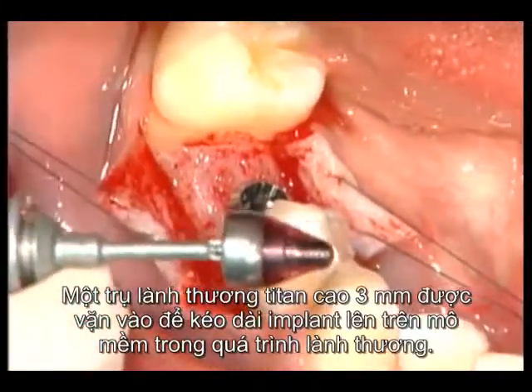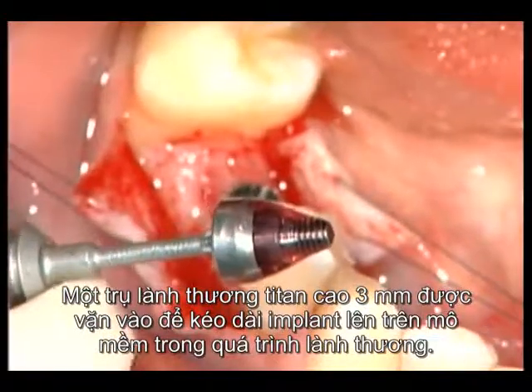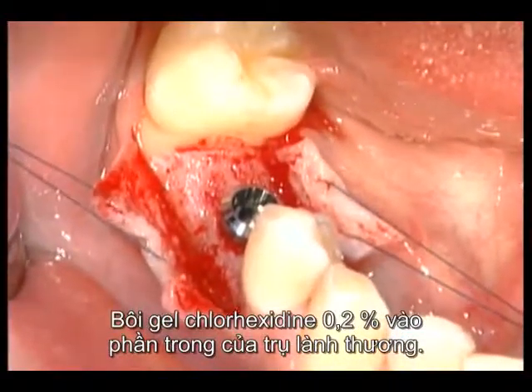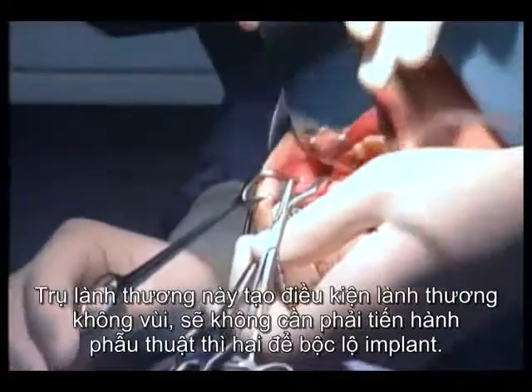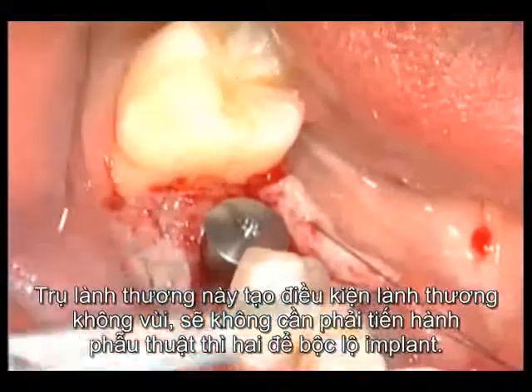A 3 mm titanium healing cap is inserted to extend the implant clearly above the soft tissue level during healing. A 0.2% chlorhexidine gel is applied to the inner portion of the healing cap. This healing cap allows non-submerged healing without the need for a second surgical procedure.